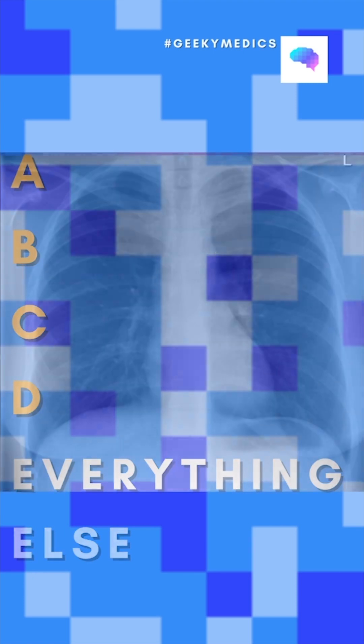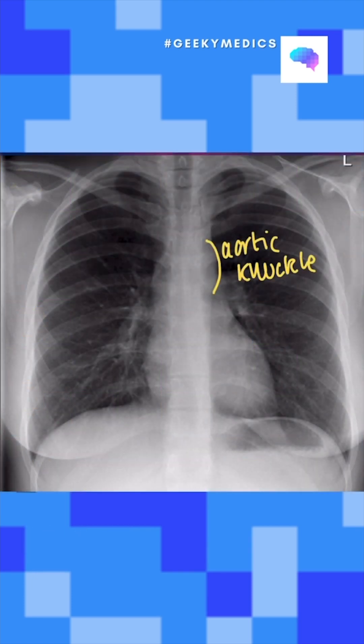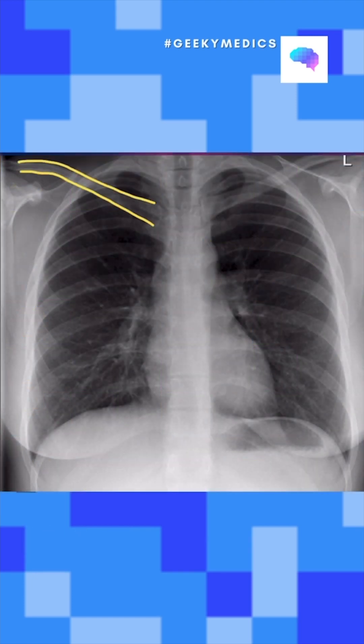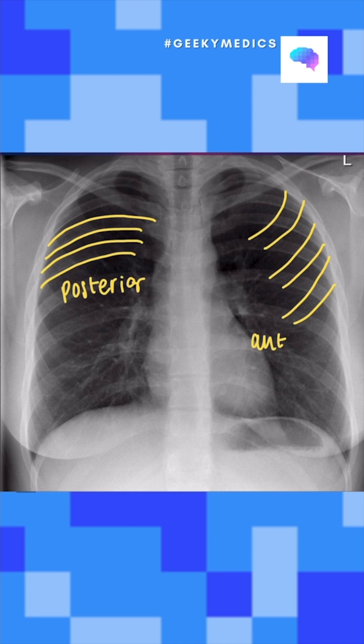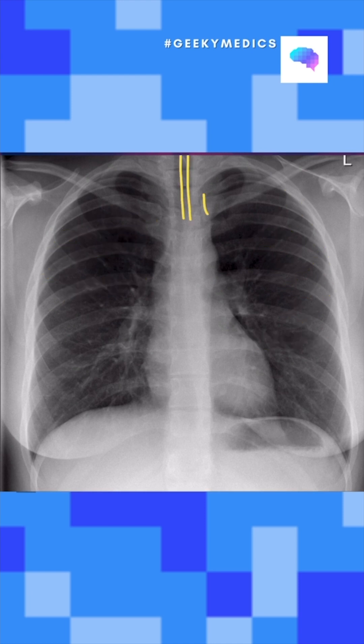E is for everything else. We want to look at things like aortic knuckles, long bones such as the clavicles and the ribs, as well as any foreign artefacts like endotracheal tubes or NG tubes.